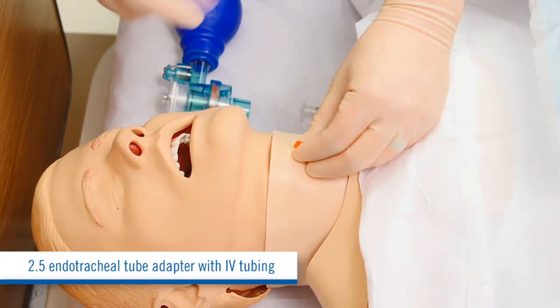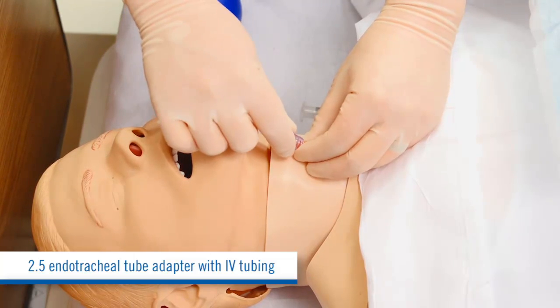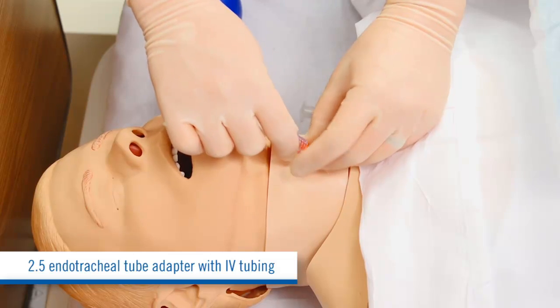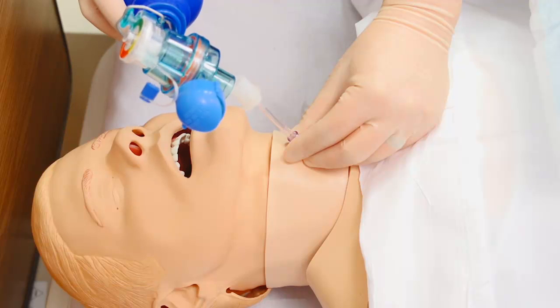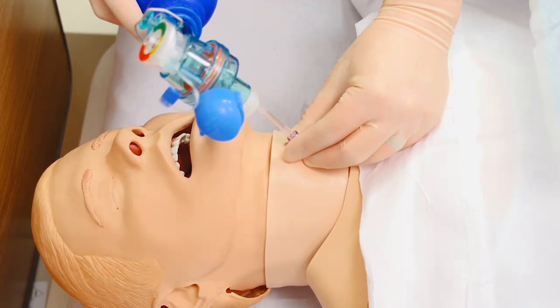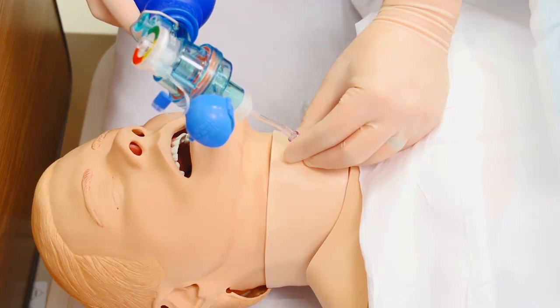Or 3, a 2.5 endotracheal tube adapter with IV tubing. This is the standard method to performing a needle cricothyrotomy and bagging without commercially available jet ventilation kits.